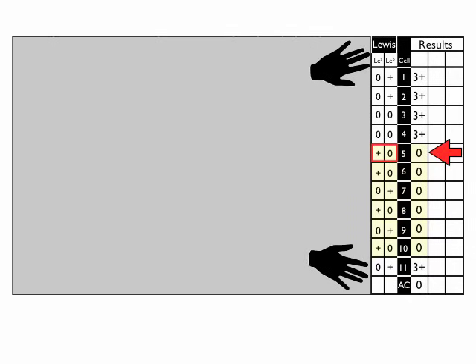So here, okay, again, here's cell 5. Here's Lewis A. We assume double dose, put a single slash. Move down to cell 6. Uh-oh, again, another double dose, no reaction. Move our pen over, take another slash through Lewis A. Now, basically, I don't have to look at any more Lewis A's for the rest of the panel. I don't have to look at 7, 8, 9, and 10, no matter what they show, because I've already got 2 solid rule outs. Again, some people just take 1 to do that, and that's totally fine.